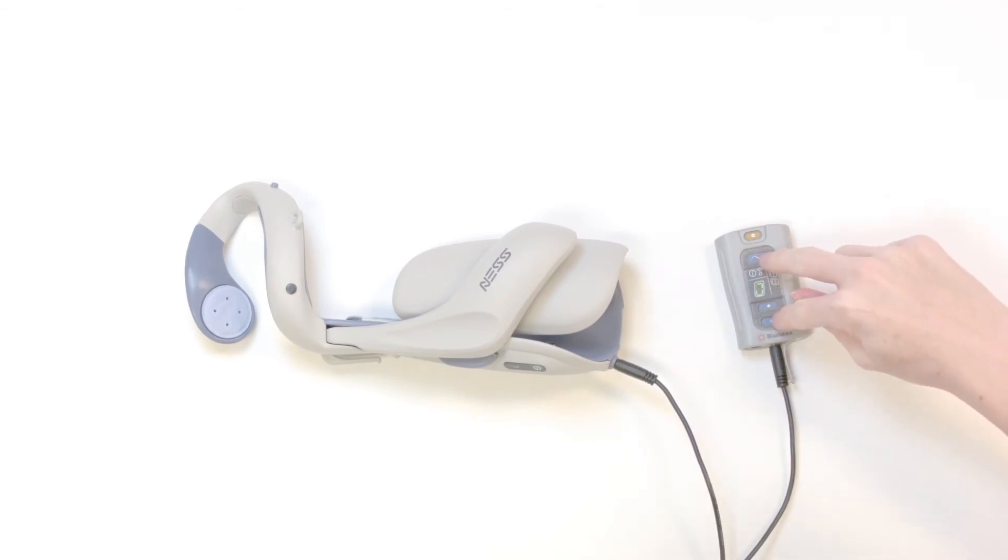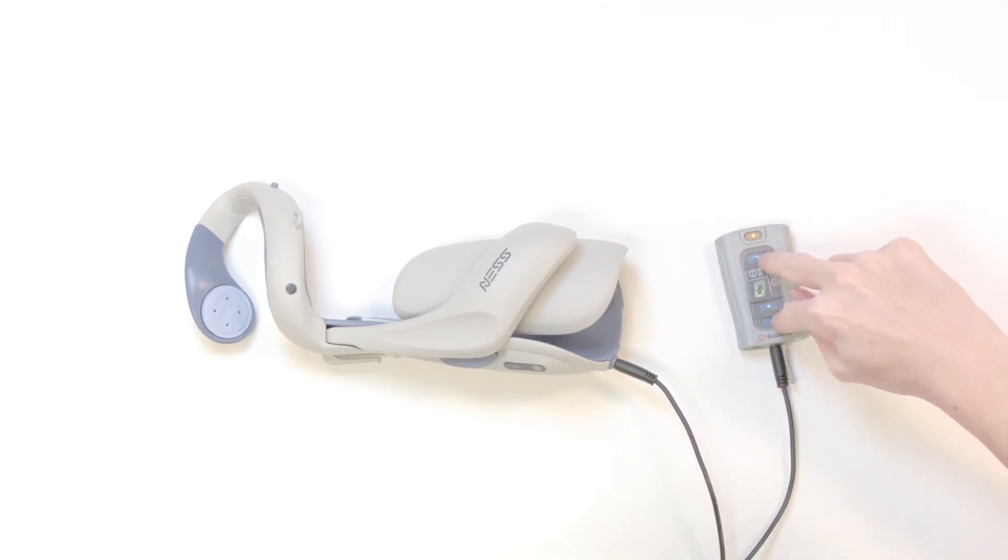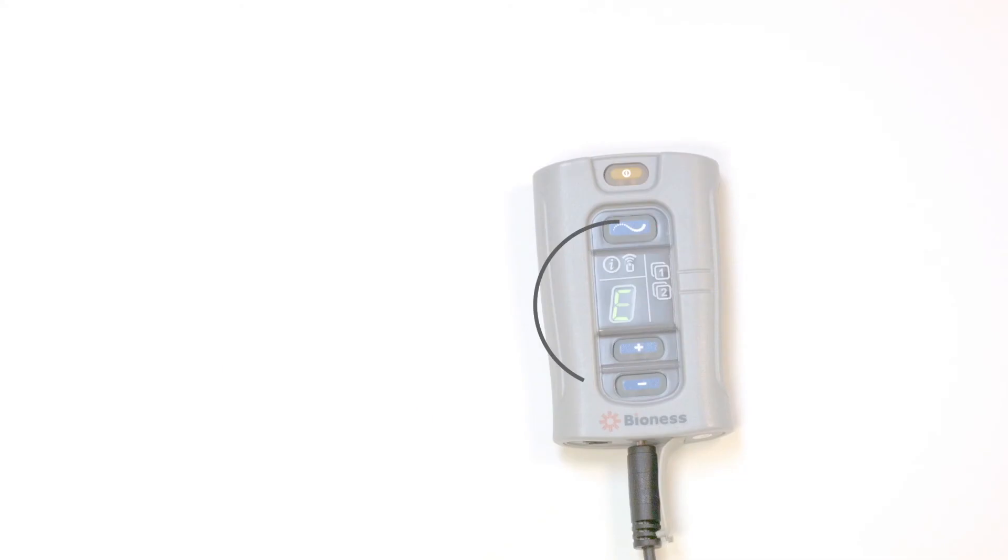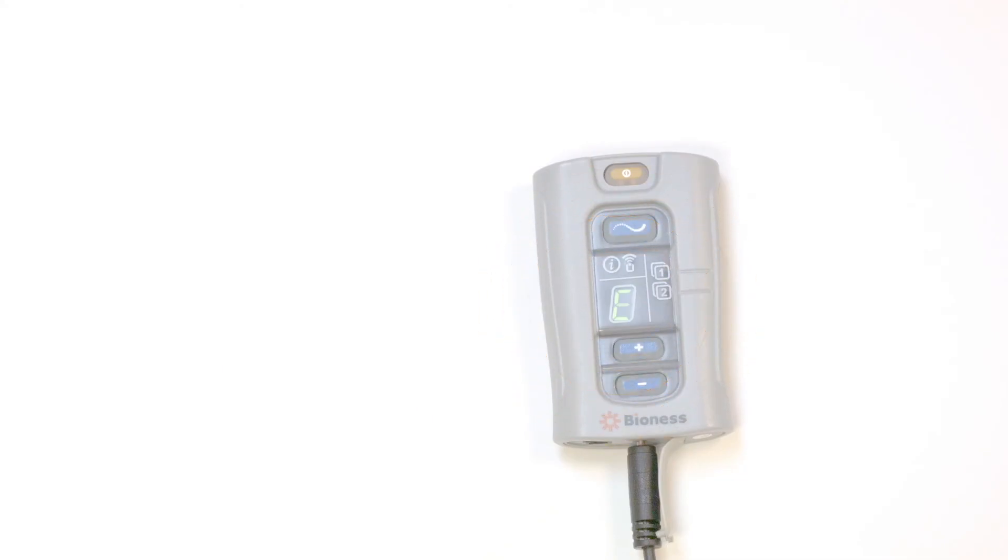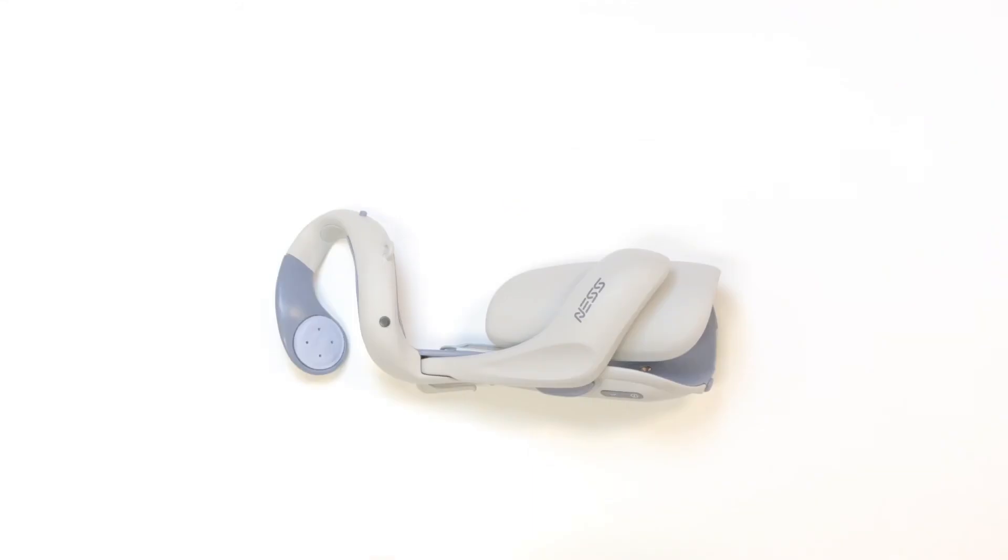In case you missed it, go ahead and try the process again from the beginning. If you keep getting an E after several attempts, you may have already registered the H200 wireless orthosis.